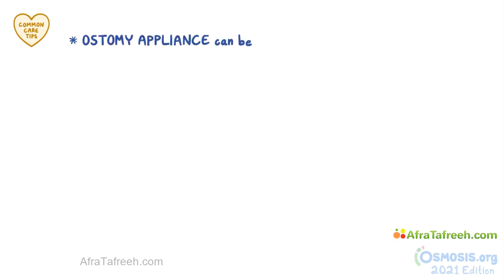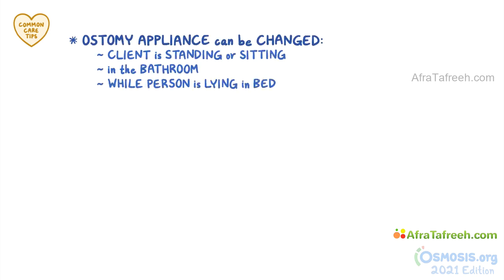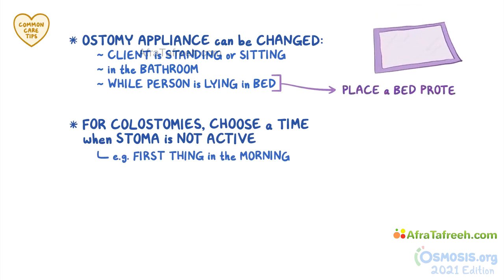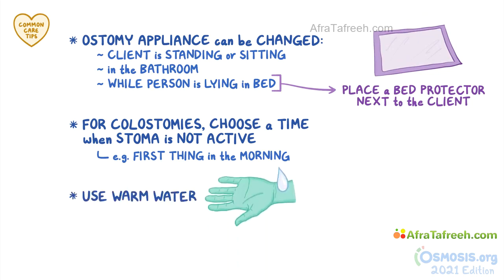The ostomy appliance can be changed when the client is standing or sitting, and it can be done in the bathroom or while the person is lying in bed. For colostomies, choose a time when the stoma is not active to provide care, such as first thing in the morning. If you're providing routine ostomy care in bed, place a bed protector next to the client to prevent the linens from getting soiled. Make sure to use warm water for ostomy care, and make sure it's at a comfortable temperature by testing it with the inside of your wrist.